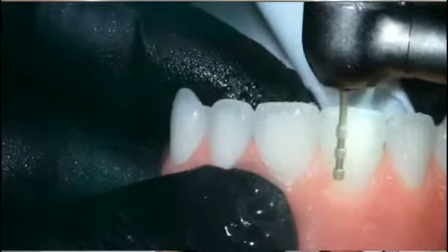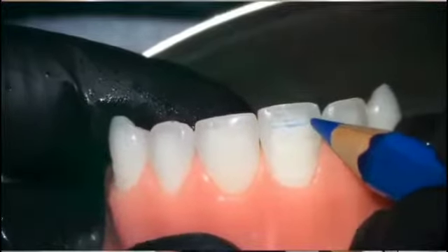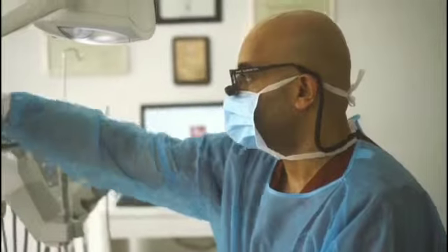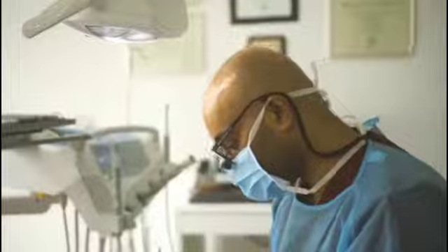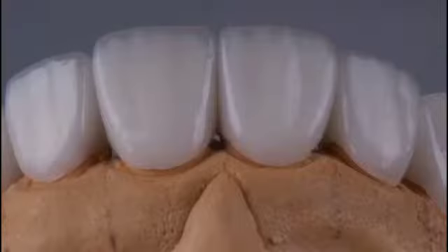Prep, scan, design, mill and delivery. This course will provide a unique exposure to all of the attendees where they have to actually practice a hands-on course on all of the different stages of CAD-CAM technology using one of the most modern scanners and milling units in the market.